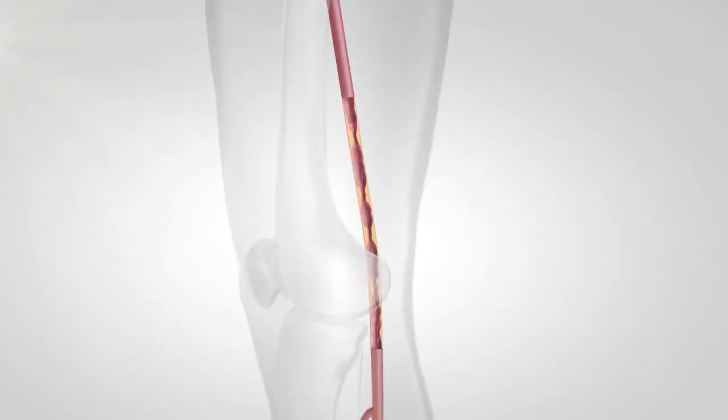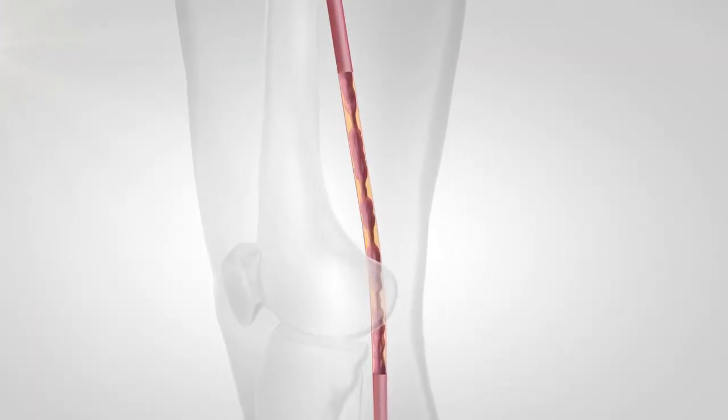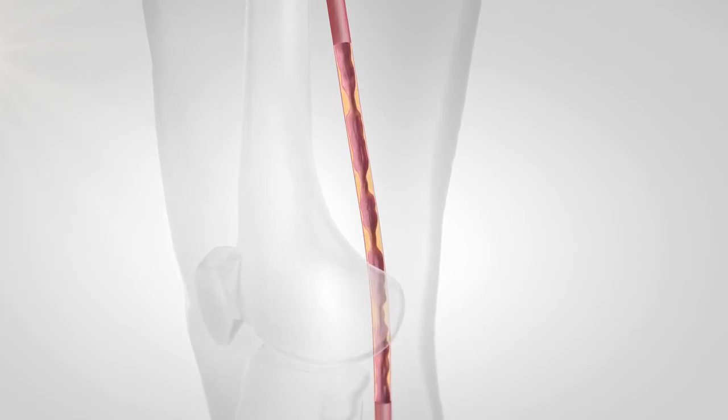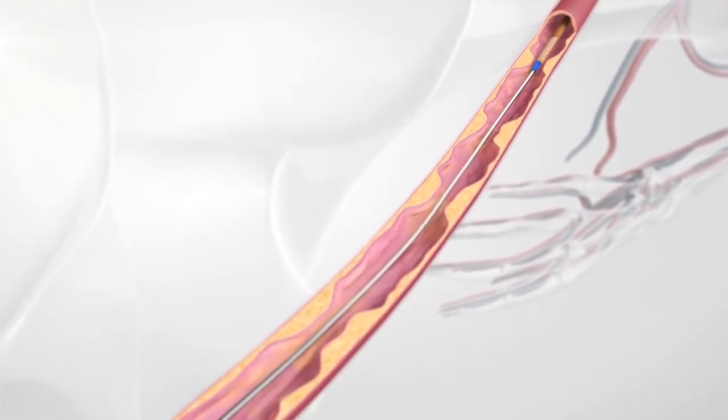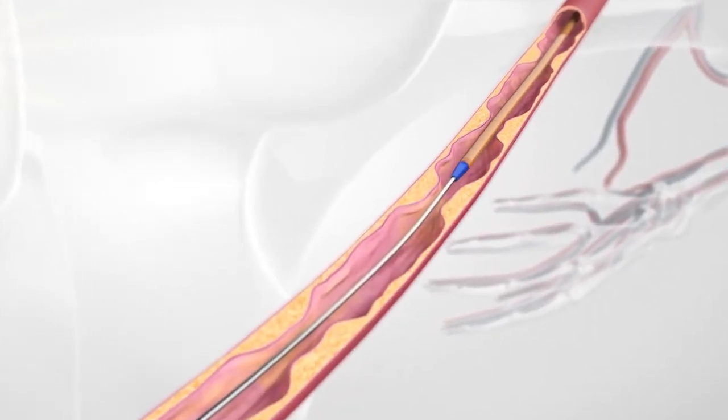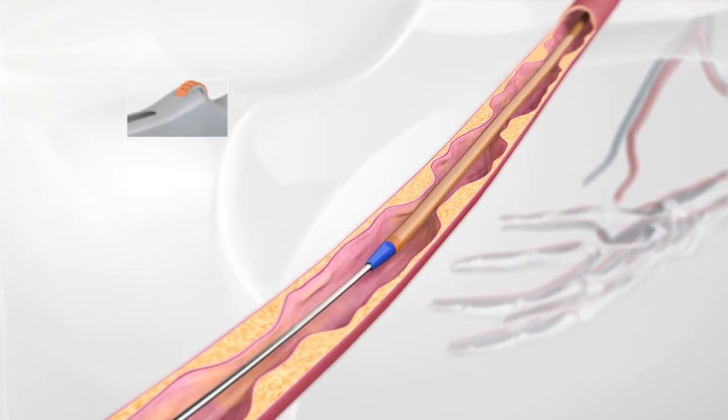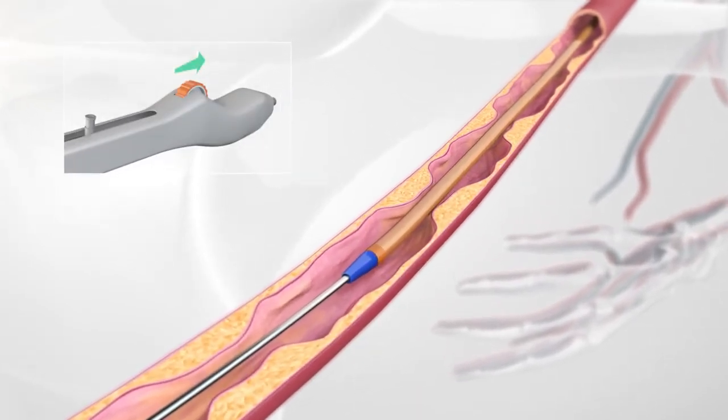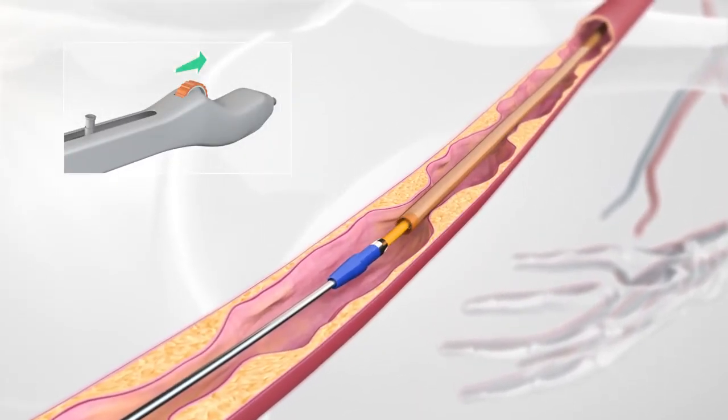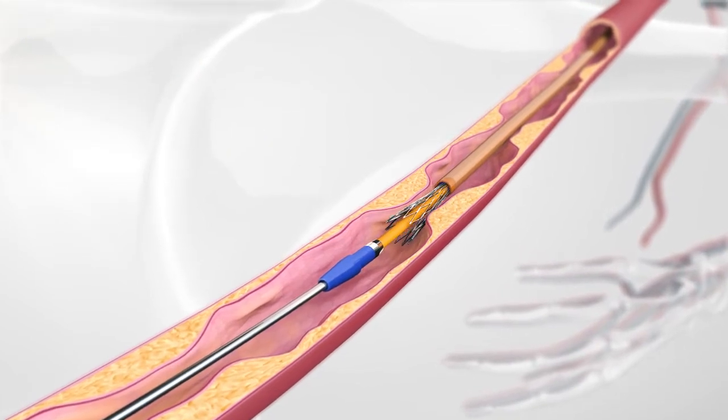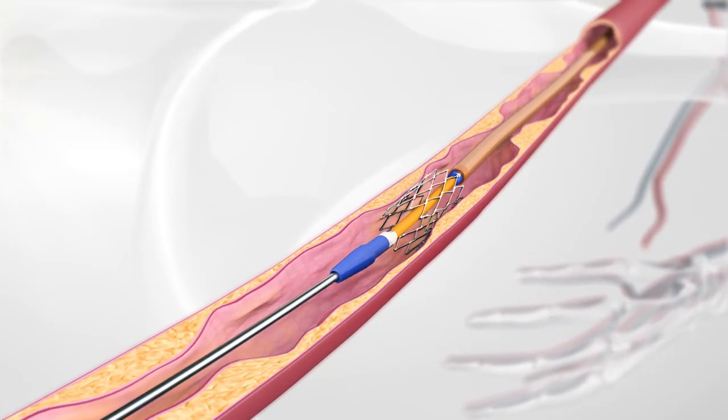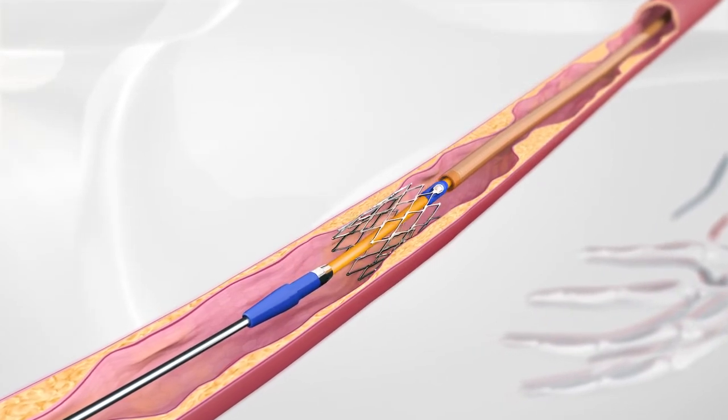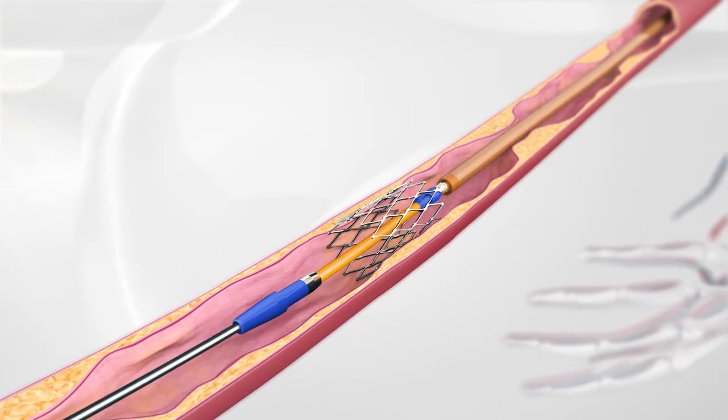In this example, four highly calcified lesions are in a 13cm long segment. After predilatation with a balloon catheter, the first short stent can be implanted. By turning the wheel on the handle, the stent is released into the lesion of the vessel. The stent is completely released once the marker band is unlocked from the mount point.